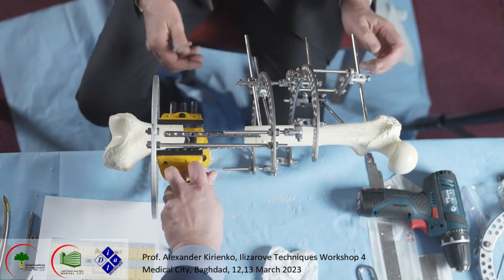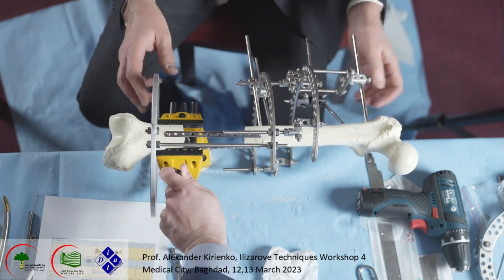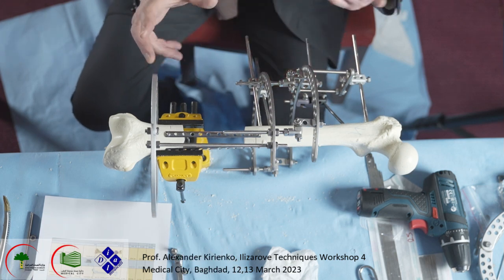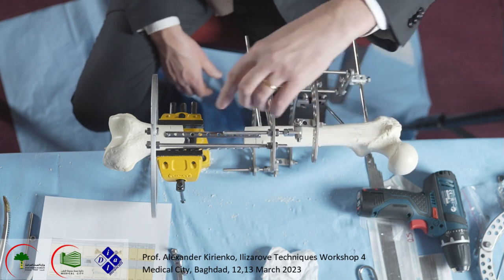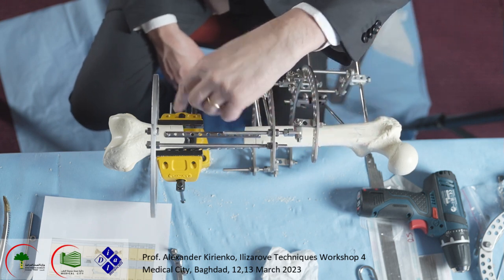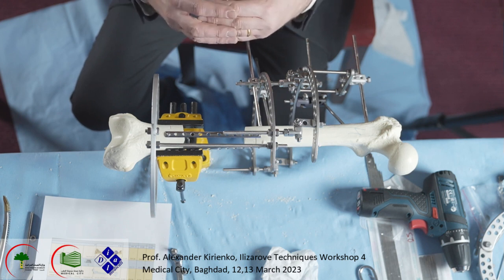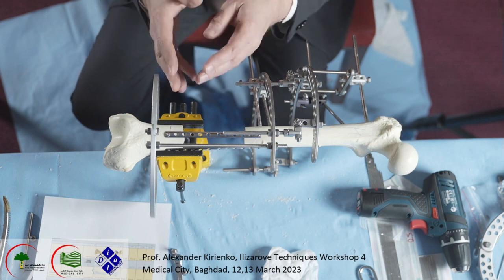Okay, now we do like this. If you are not sure about the correction, you may build the same system distally with the hinges, because what may happen is you do compression, but sometimes it goes into varus or valgus, and you may use these hinges.